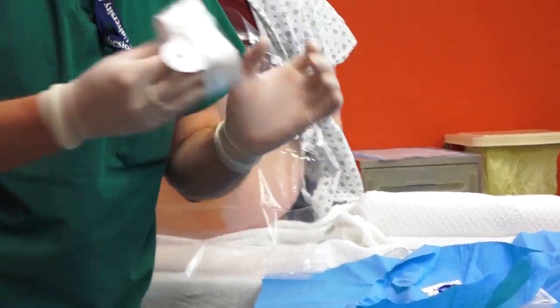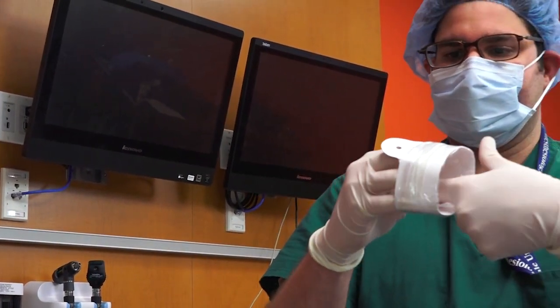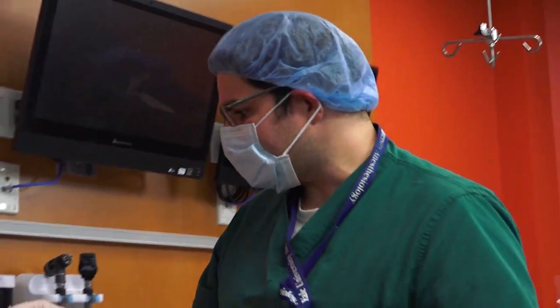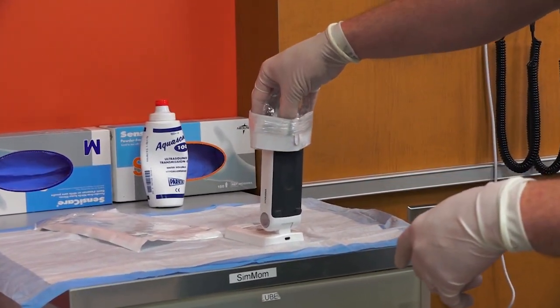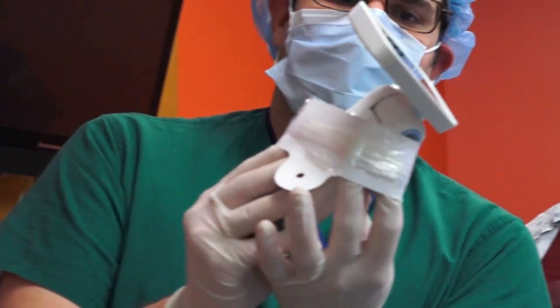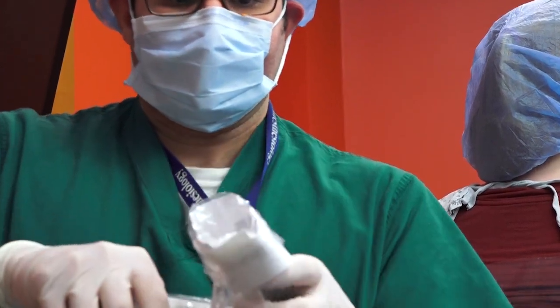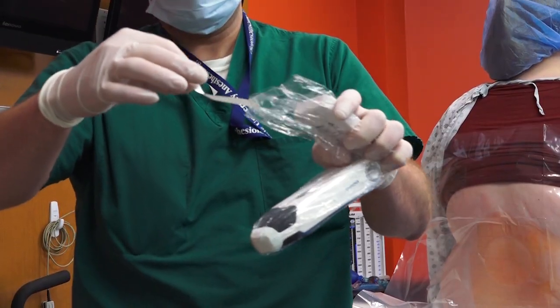The sterile cover is very easy to use. Just place your hands so that you can securely introduce the ultrasound. While the ultrasound is on a secure surface, just grab the ultrasound, hold steady, and make sure that you don't touch the ultrasound at any point after that. Then roll the sterile cover.